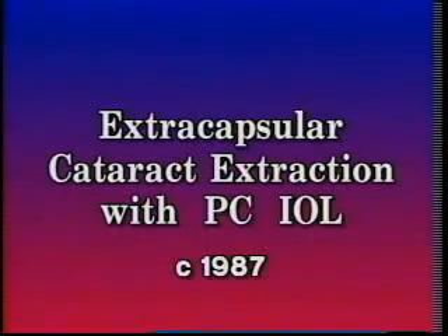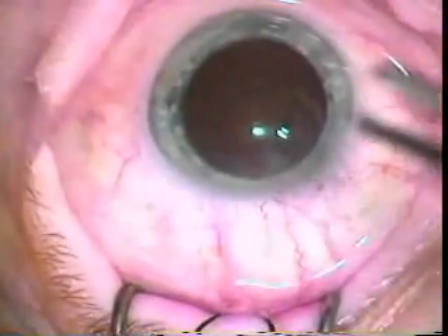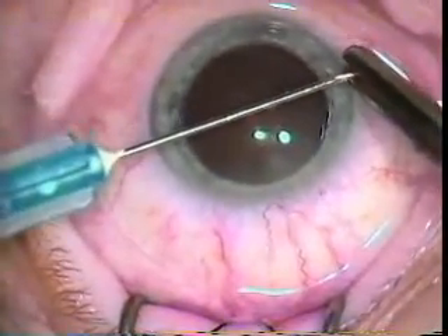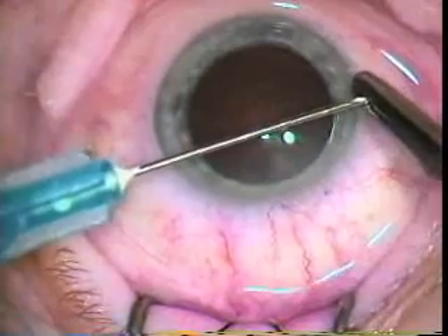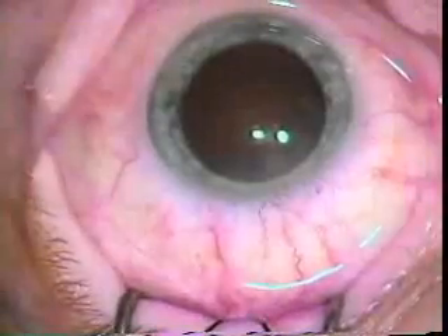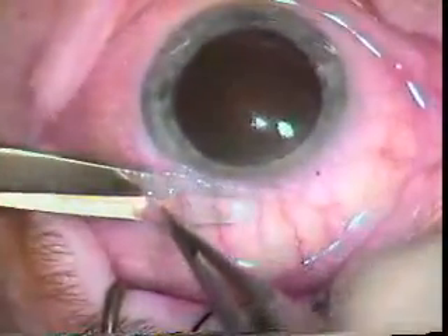Here's an example of an extracapsular cataract extraction that was done by Dr. Colder in the late 80s. You can see at this point we would bend our own cystotomes. This is a 27-gauge needle — Dr. Colder is bending it himself to allow him to do the capsulorrhexis.